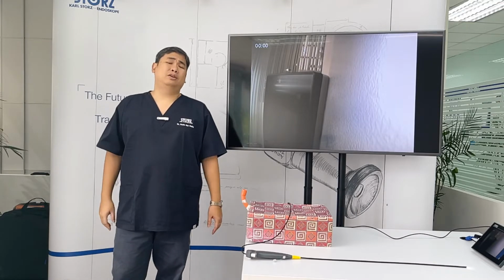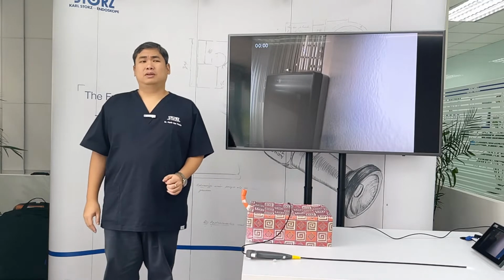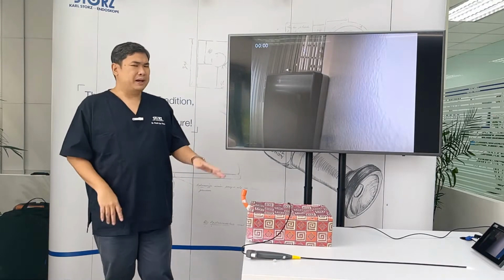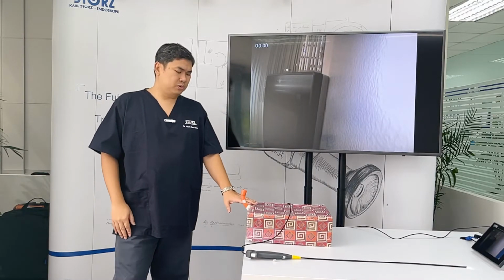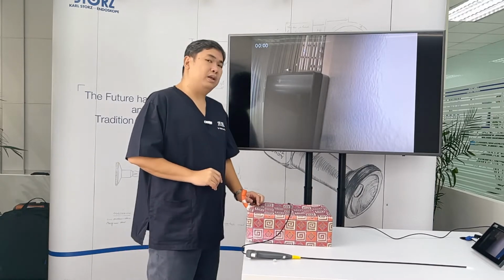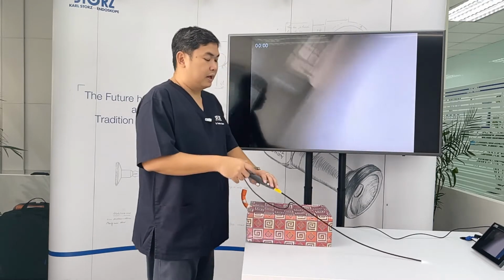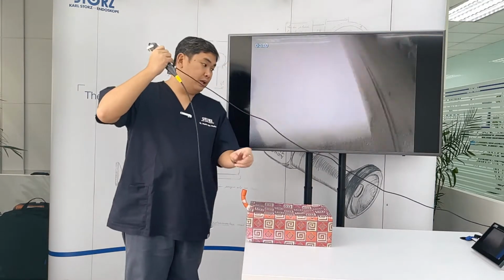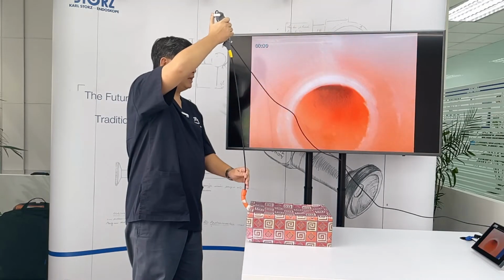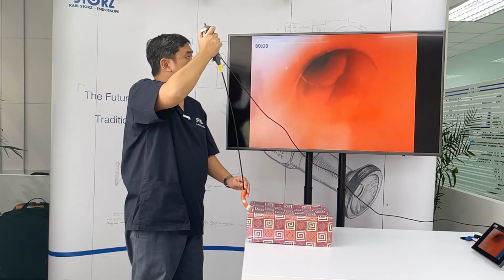When I decided to learn flexible endoscopy, there were flexible scopes available. However, mannequins that are good in bronchoscopy are not that easy to find. So, I decided to create my own bronchoscopy trainer. So, I made paper mache to simulate the path of the airway and I painted it orange.